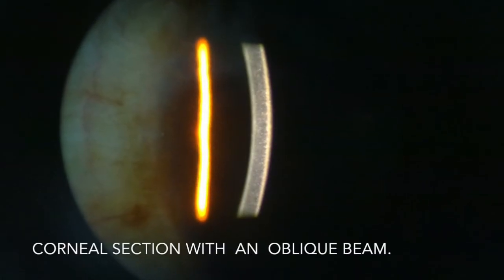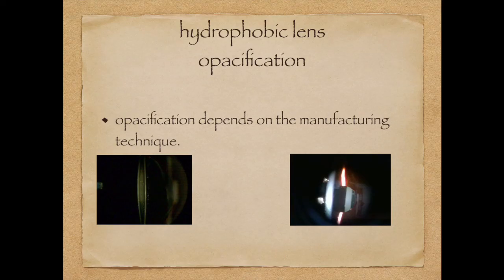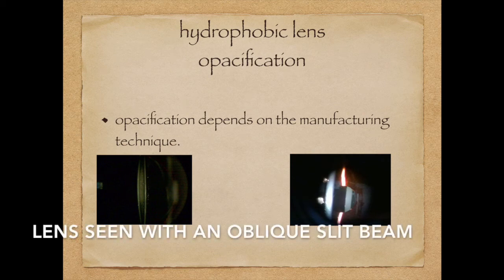Opacified imported hydrophobic intraocular lenses. My friends, it's very difficult to find a fully clear intraocular lens like we can see in this patient. An intense oblique beam will show changes in our hydrophobic intraocular lenses. The changes seem to depend on the manufacturing technique.